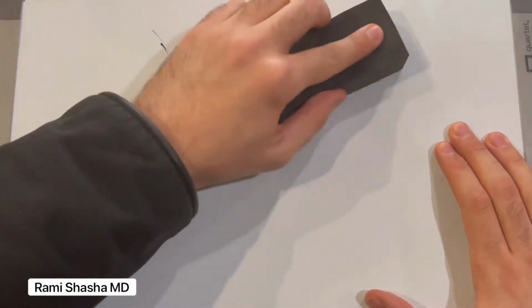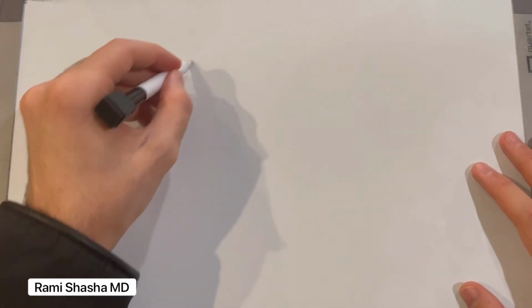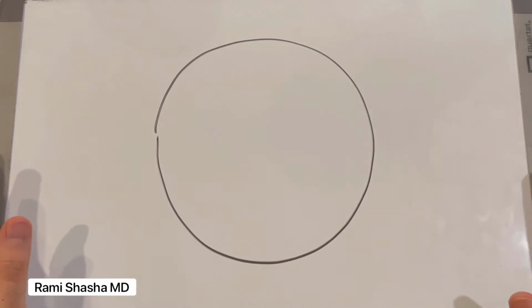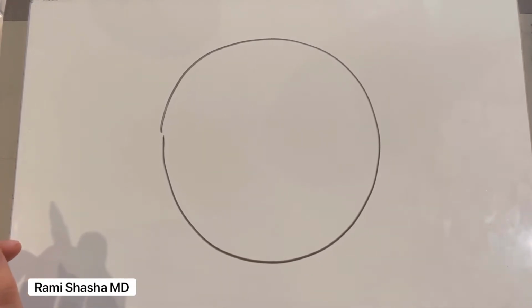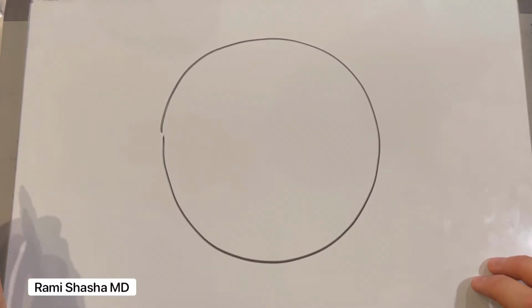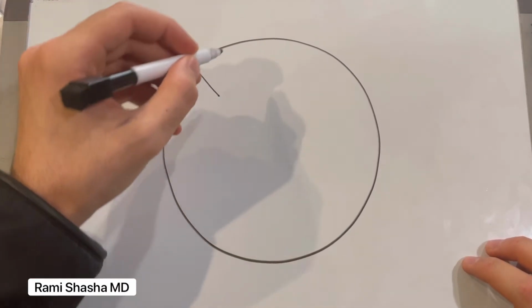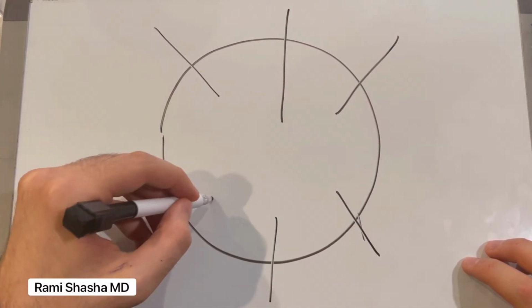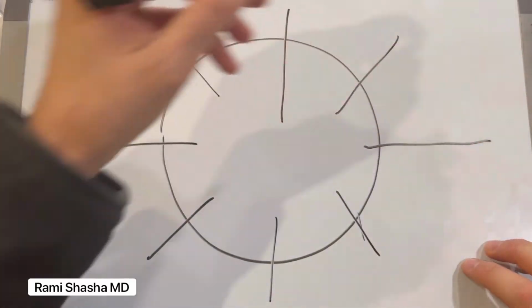So what is the management? What to do if you see these kinds of cases? Well, the first step is recognition. So what I do is for all my cases, at the very beginning, I take a split 1 to 2 seconds just to make sure that I'm not seeing any of these long anterior zonules. But let's assume we do. So here's a case where we've got long anterior zonules. How do we approach this case?